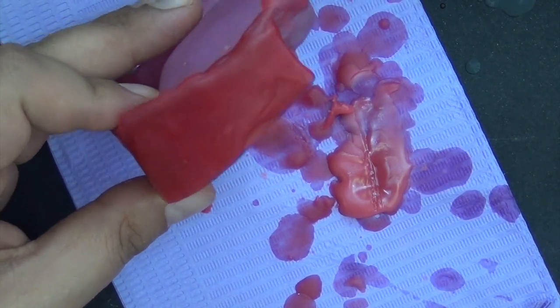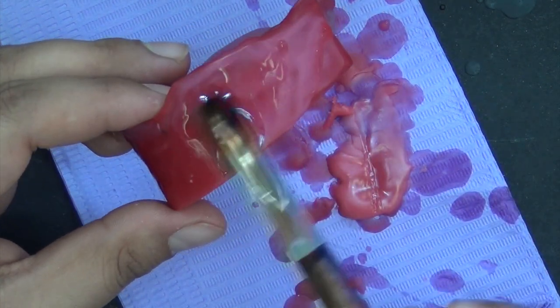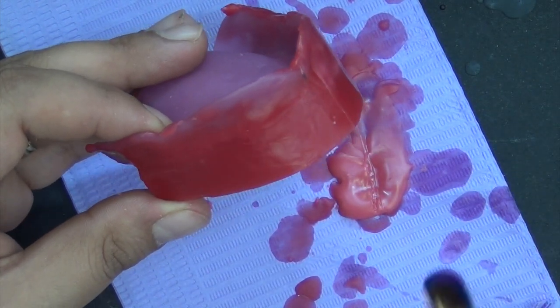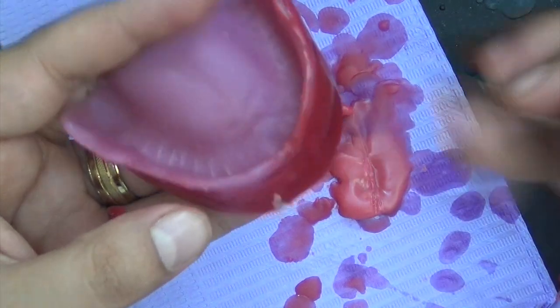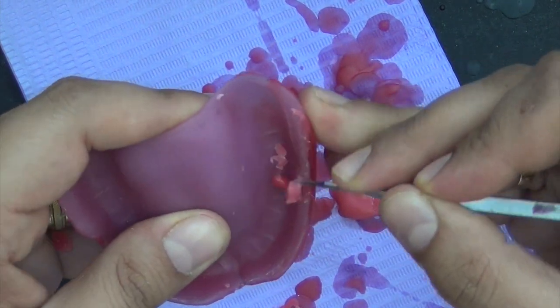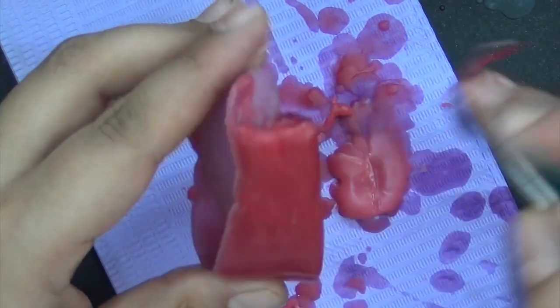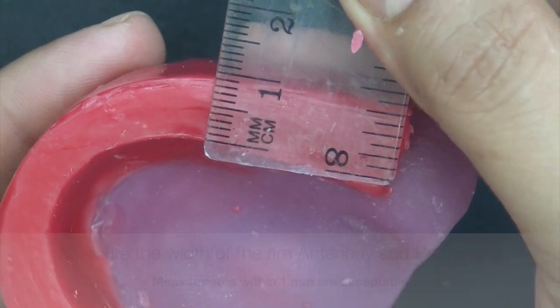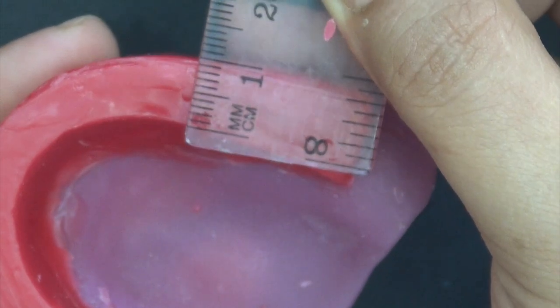Make sure to maintain the thickness of the flanges at the full depth of the sulcus, as the support is gained from the labial surfaces of the wax rim and not from the thickness of the flange, so avoid making them thick. Use a carver to remove any excess wax and to finish off the work. Measure the width of the rim anteriorly and posteriorly. Note that measurements within 1 mm of the required dimensions are acceptable.